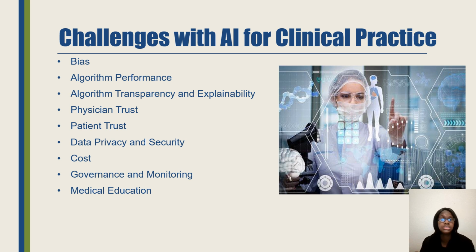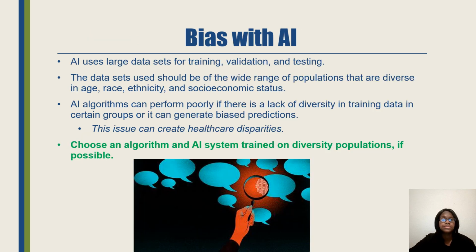You do have challenges with AI for clinical practice. You have bias, algorithm performance, physician trust, patient trust, the cost, medical education. So this is just different bias you have with AI. Using large data sets for training, validation, testing, choosing an algorithm that is trained on diverse populations if it can be possible.